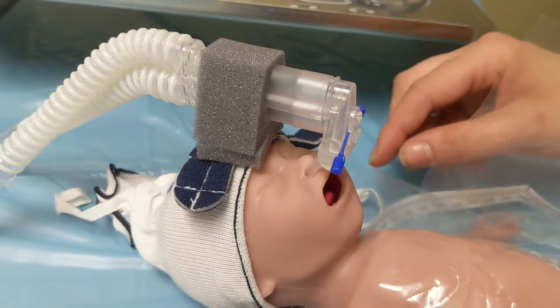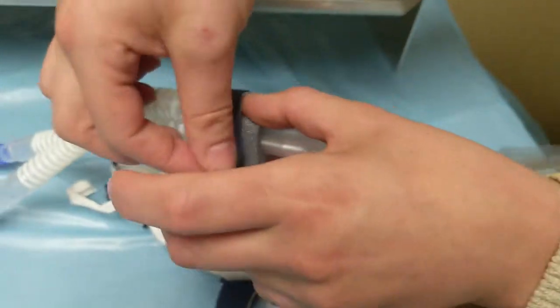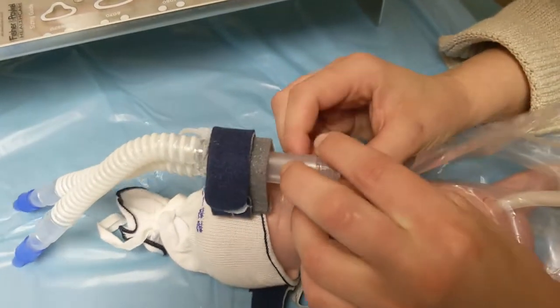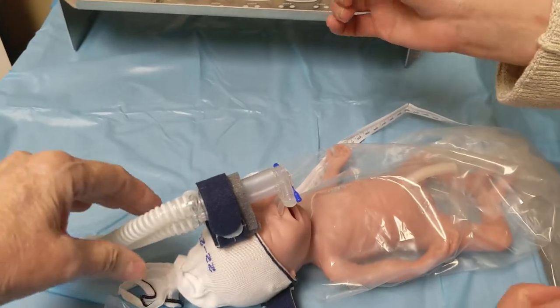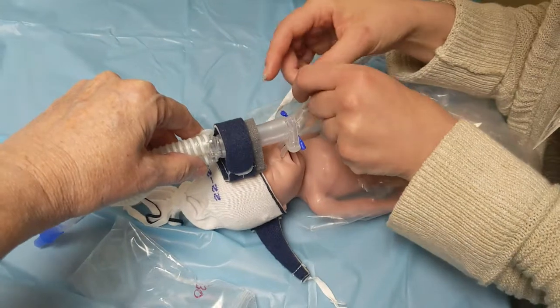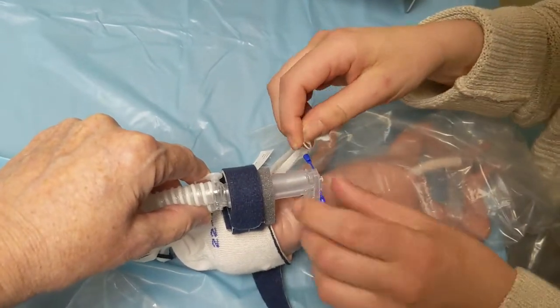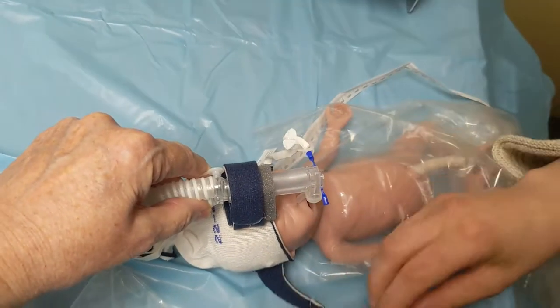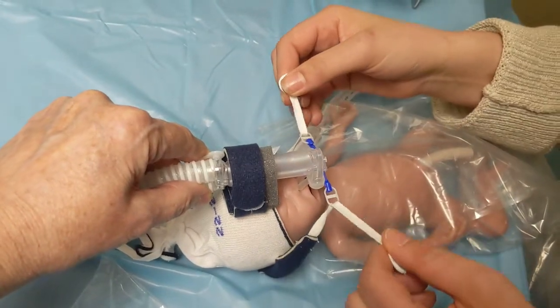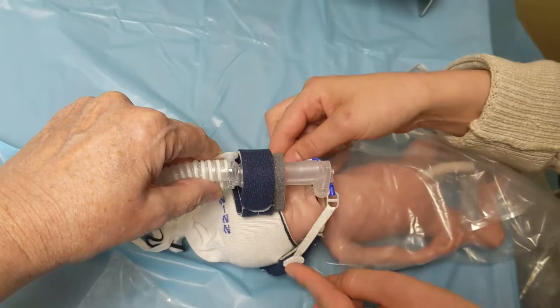Then you'll take these two straps. First you're covering this, and you want to use the least amount of tension as possible. So now that our prongs are in, they look good. We'll hook that into this blue glider and tighten simultaneously, and attach to the blue straps at the side.